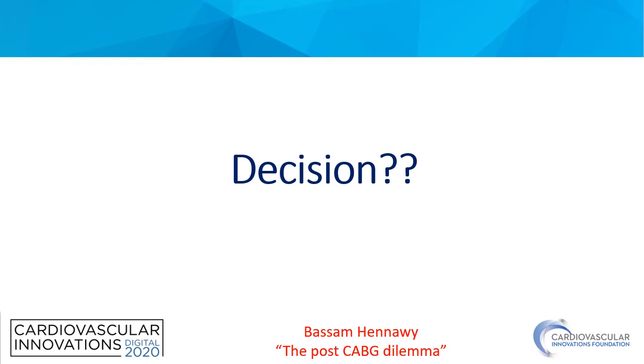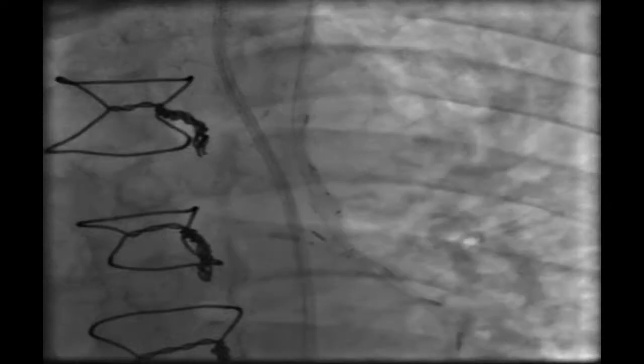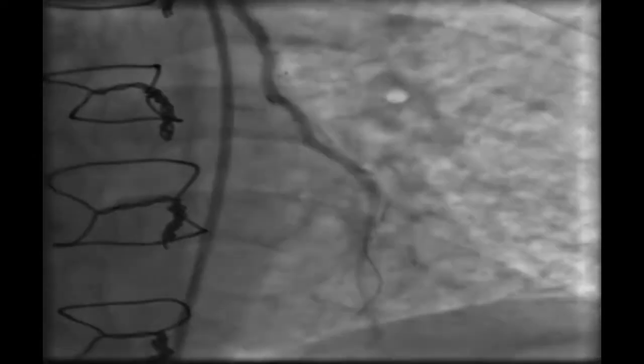We stopped to take our decision and decided to revascularize the LAD territory. We passed a wire — a run-through intermediate wire — into the LIMA, which made the selective cannulation easier.